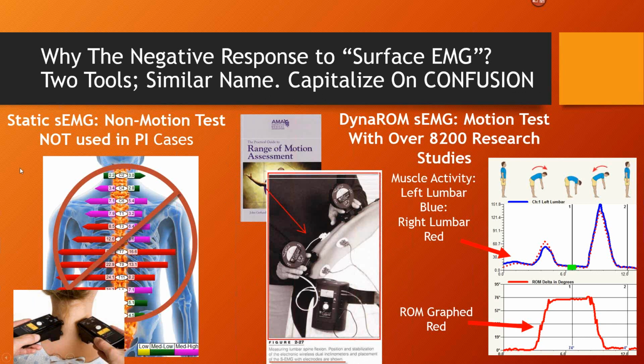But the point is that we're not doing static EMG. There's nothing wrong with static EMG. You're going to see this is a wonderful tool. You're going to see it making a major comeback due to the fact that all the machines that didn't work very well are kind of disappearing, and the ones that work really well are still around, and the ones that work well do a very, very good job.